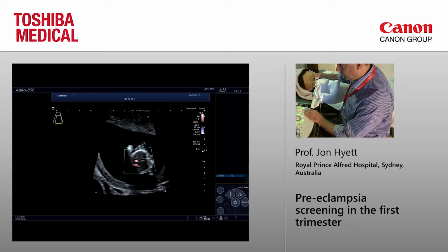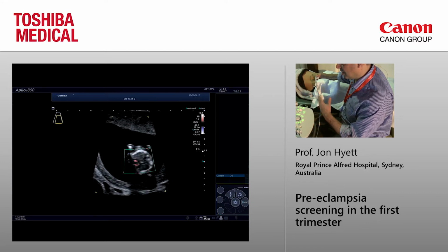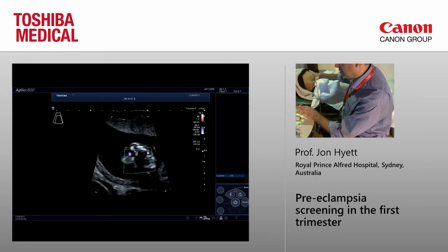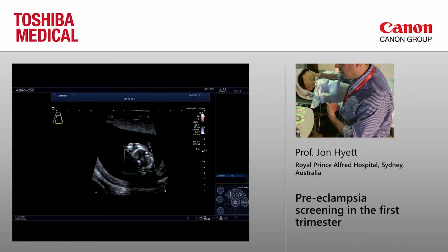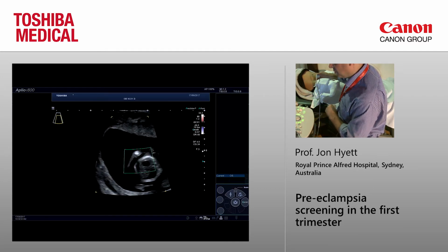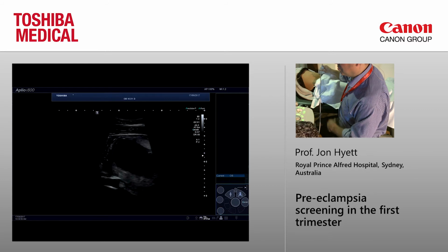And also you can see the chambers, both ventricles filling quite nicely. Occasionally as the fetus rotates, you get that view of the left ventricular outflow tract, and then the right ventricular outflow tract and the vessels coming up to the head and neck. So I think that all looks quite nice. What we might do is just whiz off and do our uterine artery Doppler for a moment.